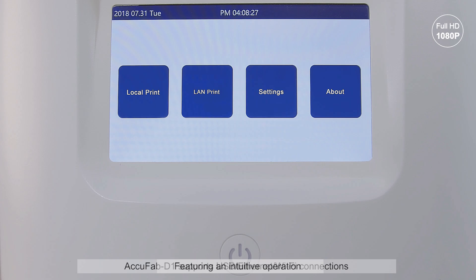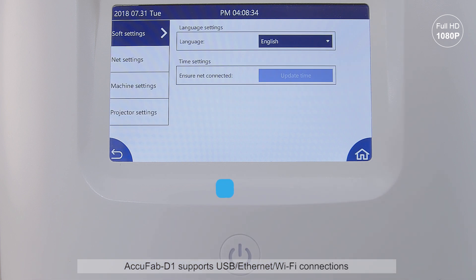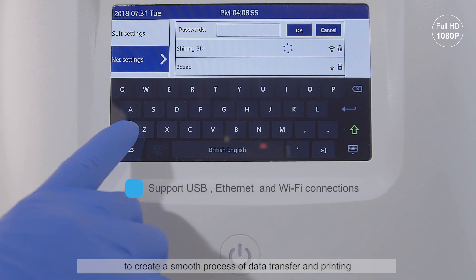Featuring an intuitive operation, AccuFab D1 supports USB, Ethernet, and Wi-Fi connections to create a smooth process of data transfer and printing.